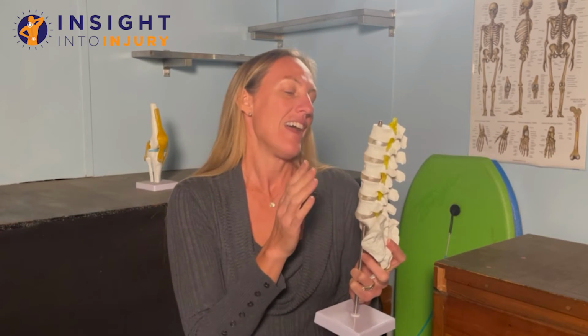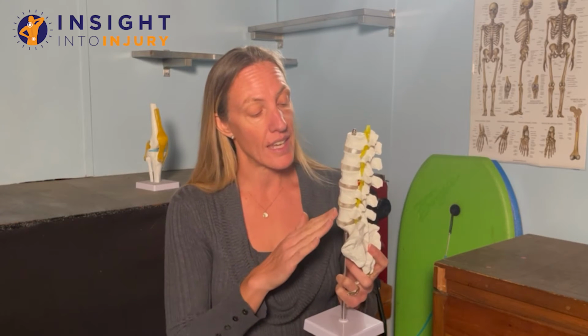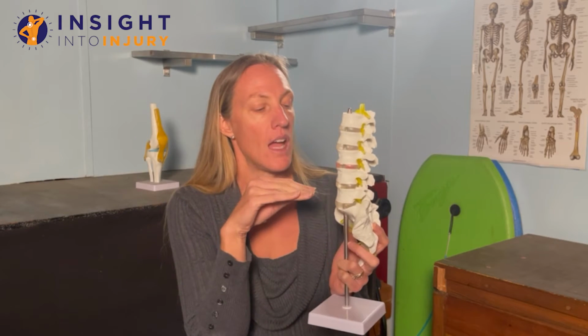So anyway, this degenerative disc disease, they might describe it in 3 different categories: mild, moderate, or severe. And just as those words suggest, there are different degrees of how intense that degeneration is. Degeneration, arthritis, kind of the same idea. So as they're looking at the MRI, if there's a degenerative nature about your disc, it might be a little more squished together. They won't see it spread out as far in between the bones. It'll kind of be flatter. It won't have as much viscosity or juiciness or cushion for it.